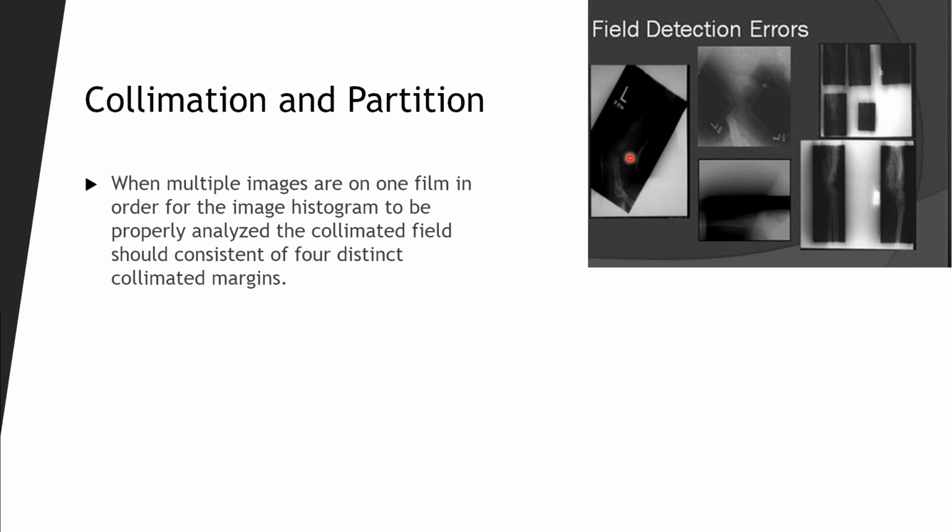With post-processing, we can typically, on the systems, select the area that is intended, that is actually exposed. We can rotate the image and do all these post-processing things, and then we can tell it to reprocess, go through its digital imaging steps, and then the image should be represented clearly.